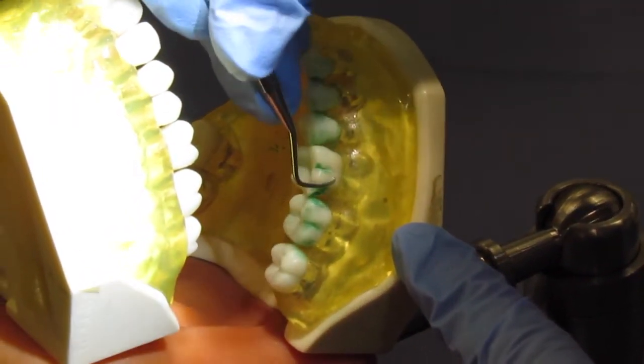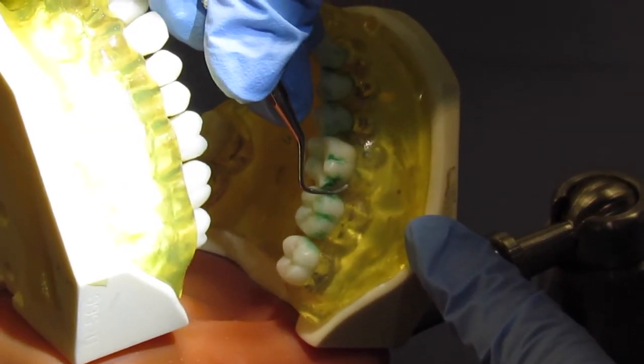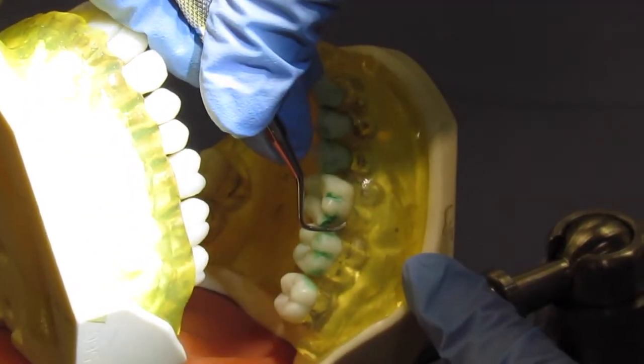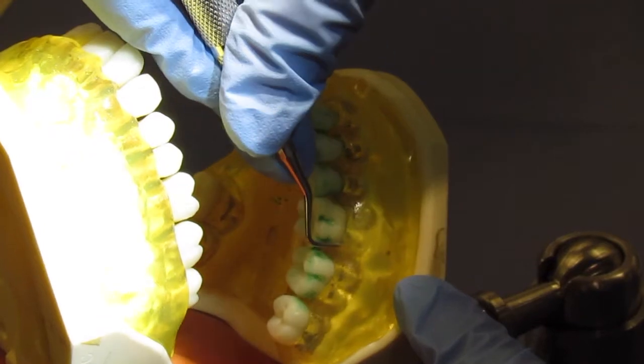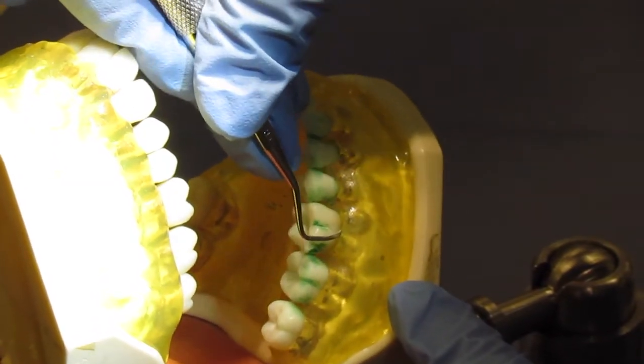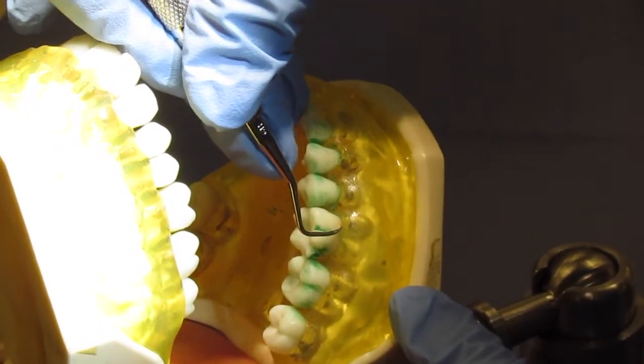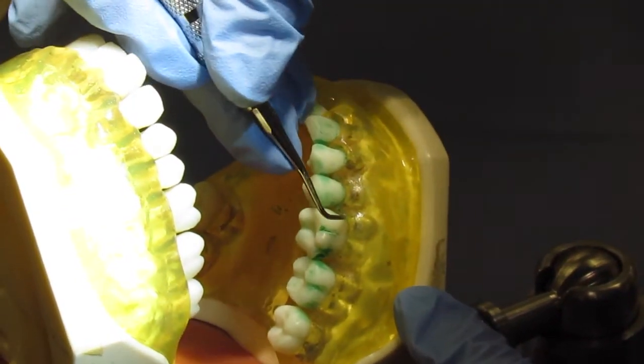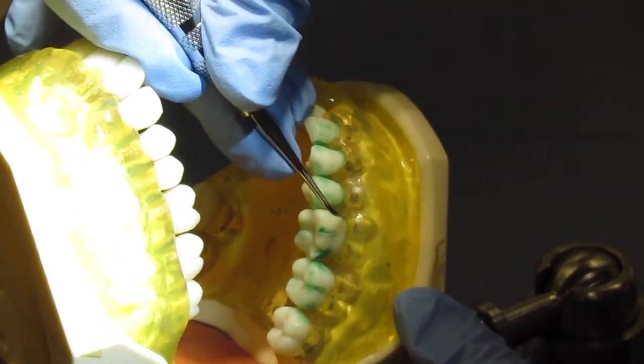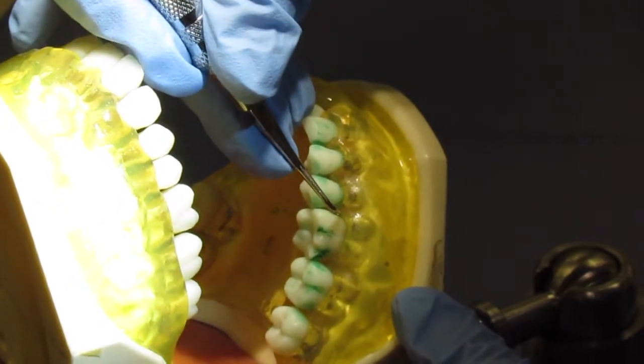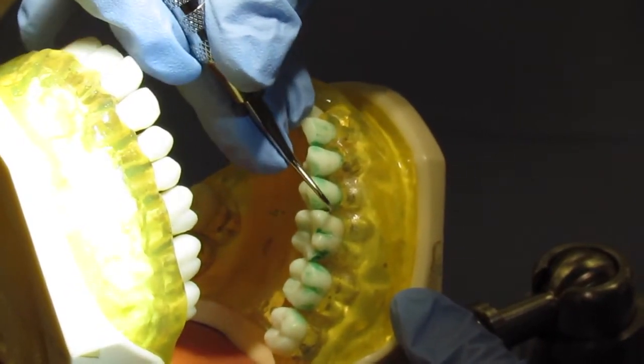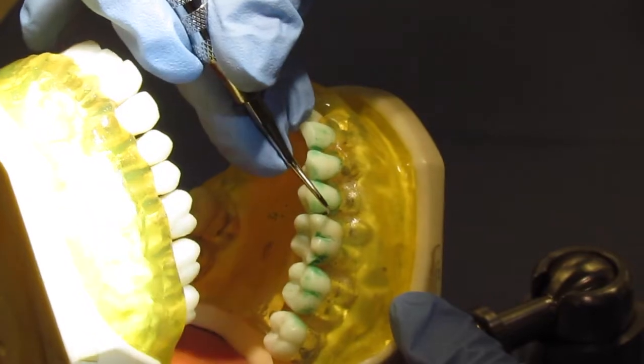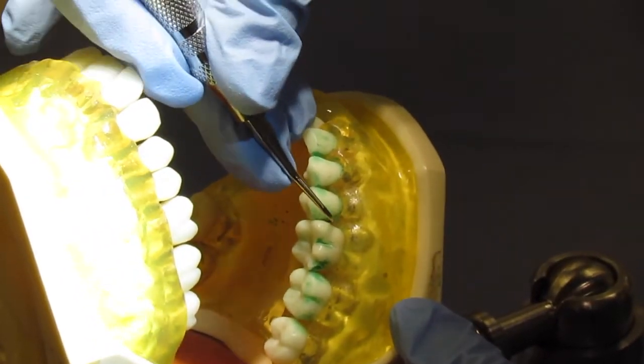Take it out. Bring the toe so it's coming toward the mesial. Raise your hand high on your fulcrum finger and then little overlapping strokes. These are going to be oblique strokes. You're rocking up and down sideways on your wrist and fulcrum finger. Finally, all the way into the mesial and then up and down strokes or vertical strokes in the mesial area.